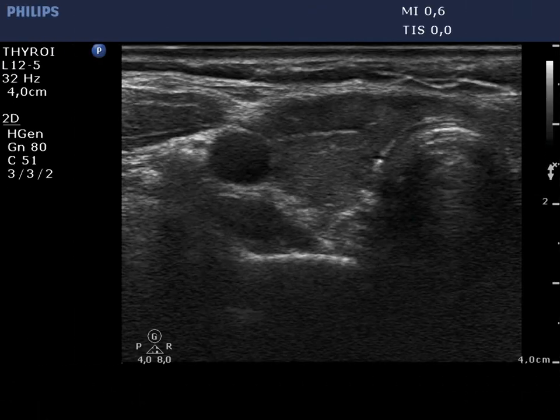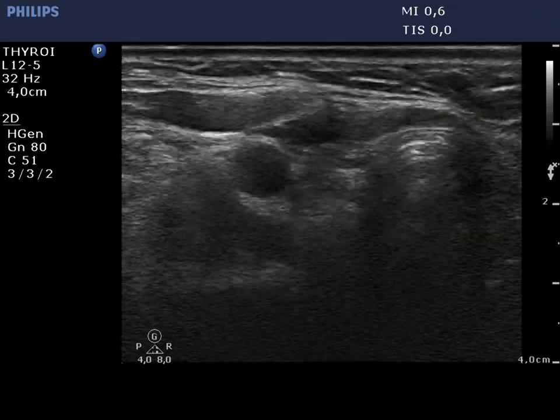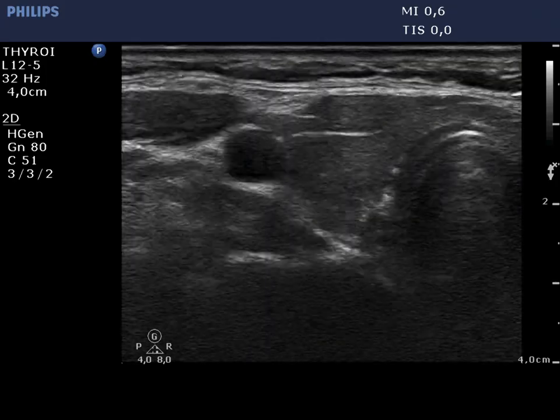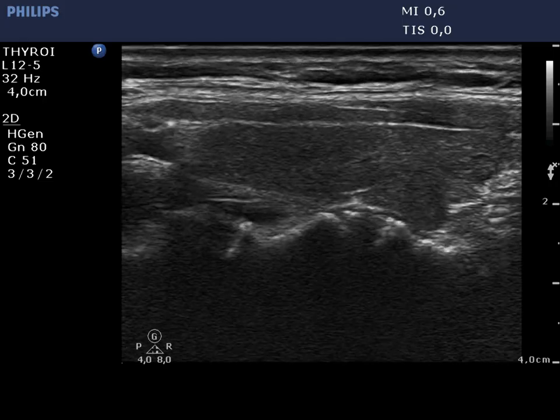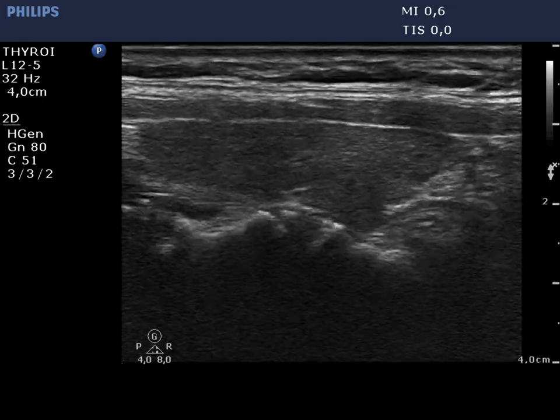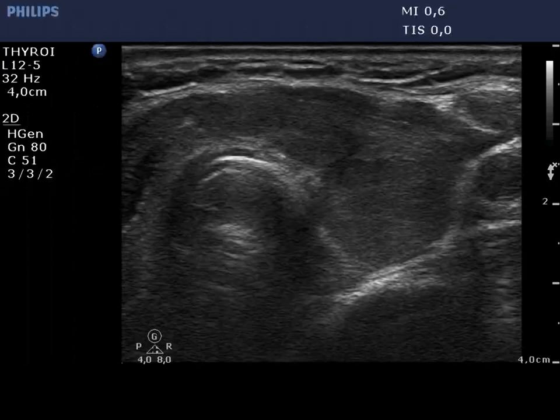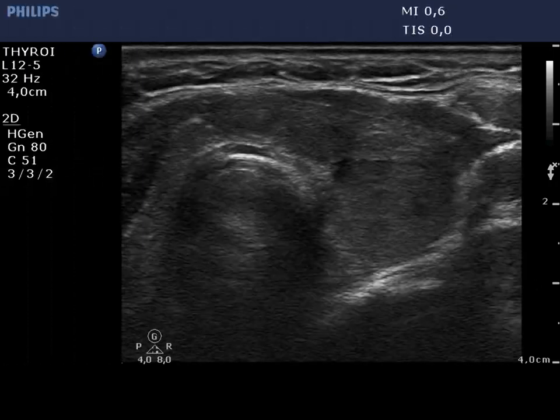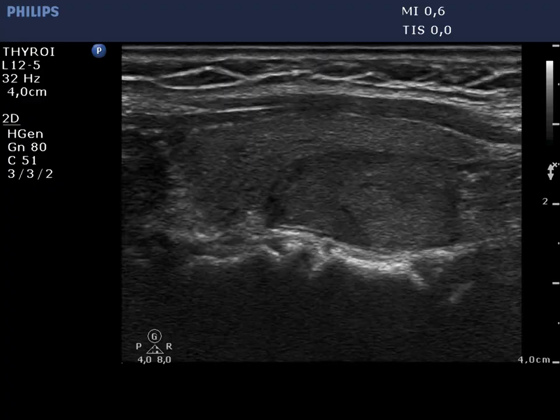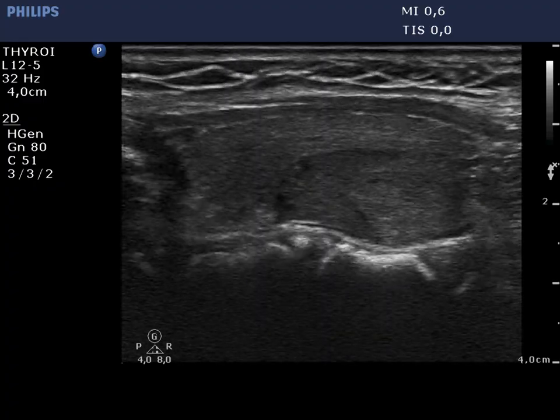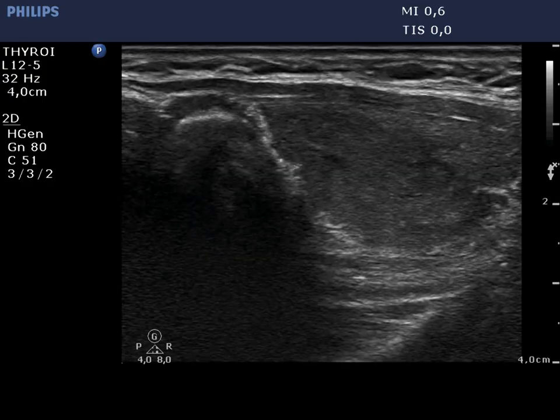The right thyroid is moderately hypoechoic without any circumscribed areas — typical presentation of Hashimoto's thyroiditis. There is a nodule-like, more hypoechoic lesion in the dorsal part of the left lobe. The longitudinal scan is decisive.